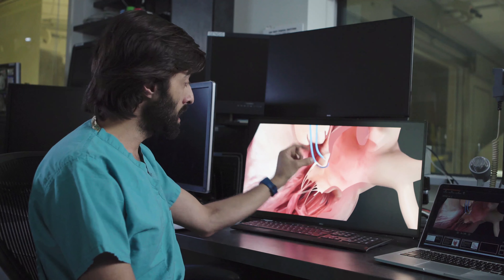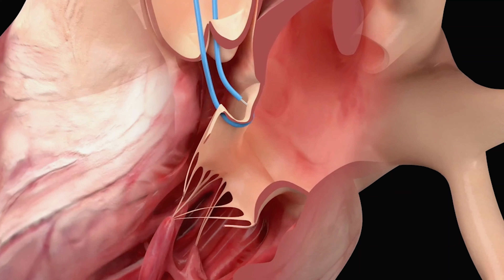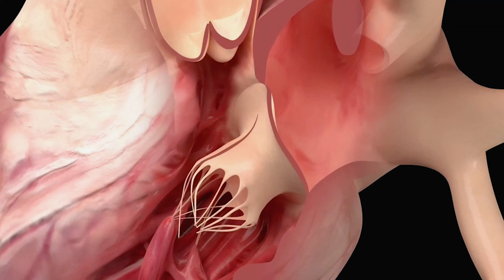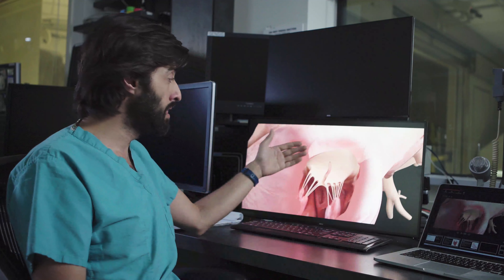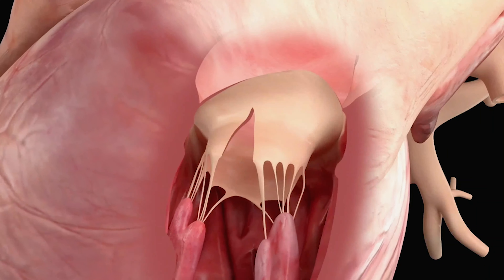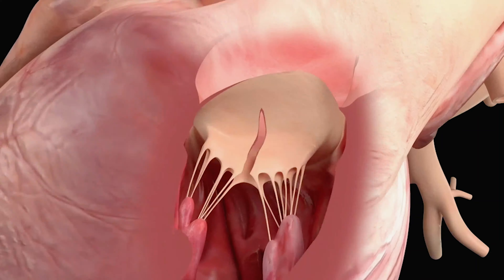Those catheters insulate the wire, and it is electrified further with the operator having both ends of the guide wire outside the body. As he pulls that wire, the leaflet splits straight down the center, and now this valve is ready for transcatheter mitral valve implantation.